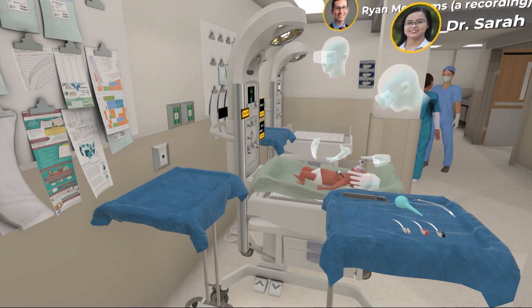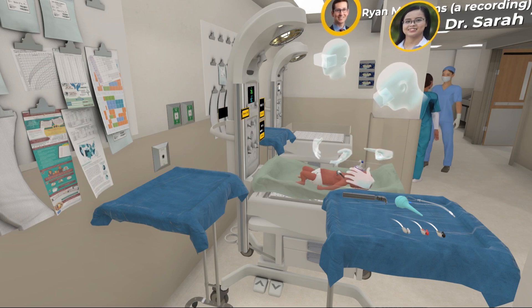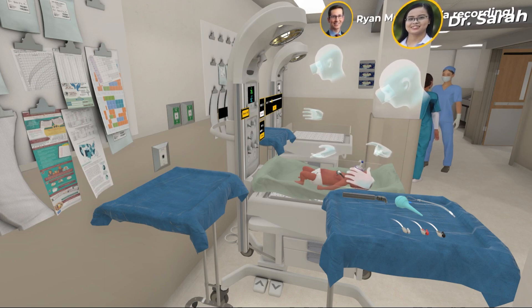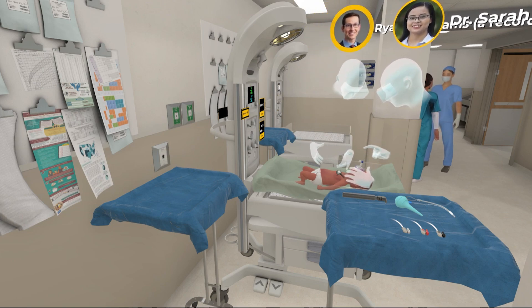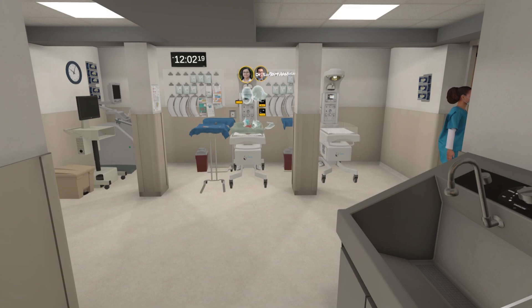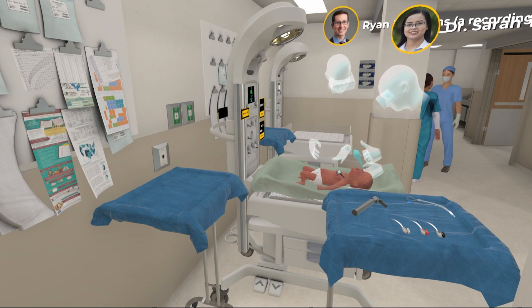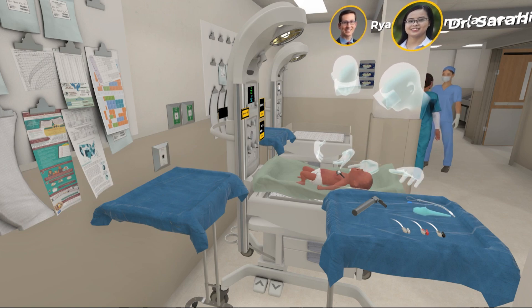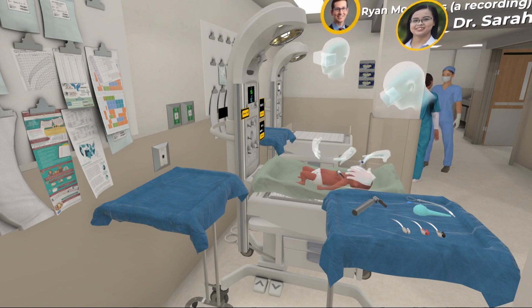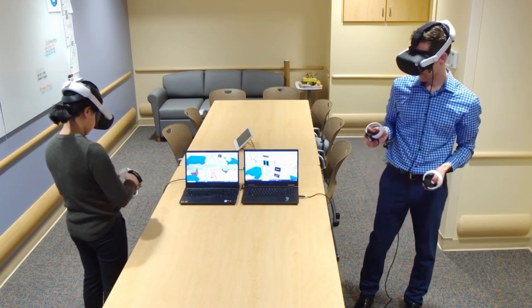It looks like you got a good seal, but I'm not seeing good chest rise yet, and our sats are still really low, as well as our heart rate. I'm going to increase our oxygen — going up to 60%. It doesn't seem to be effective, so let's see if we can suction the airway — maybe something is obstructing it. We suctioned, but I'm still not seeing good chest rise. Our heart rate's still low, sats are still in the 50s, and we're on 60% oxygen. I'm going to go up to 100%.